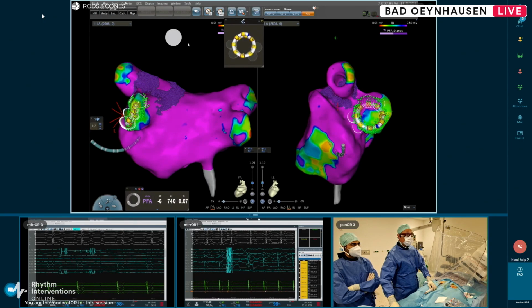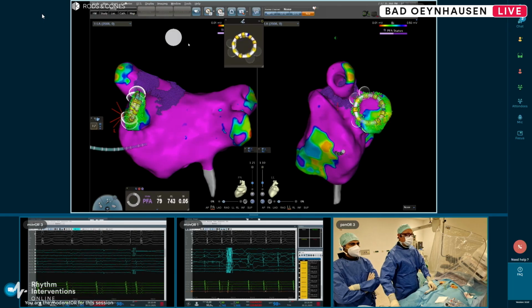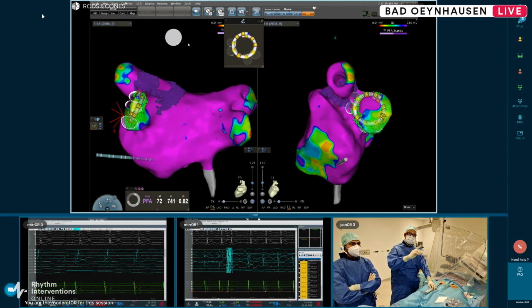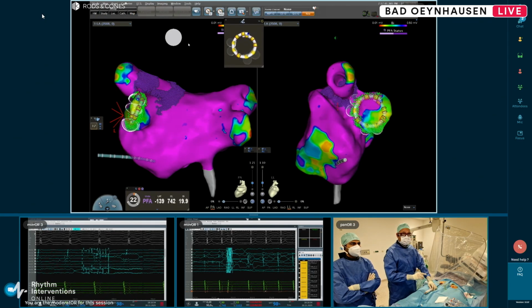We open the catheter a little bit more. You can see this now in the Cato system. And then we will pull back until we see an ostial signal somewhere. Here are some beautiful signals, look at the signals here, and that's a good place for the next application.